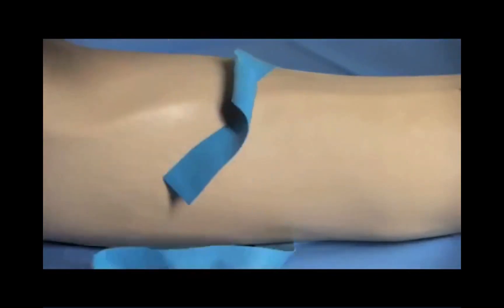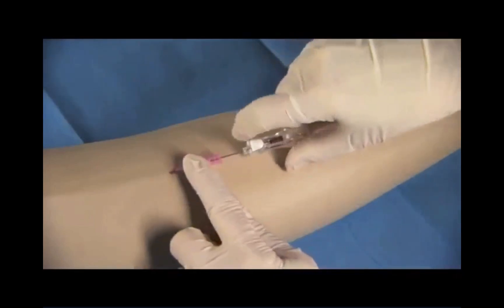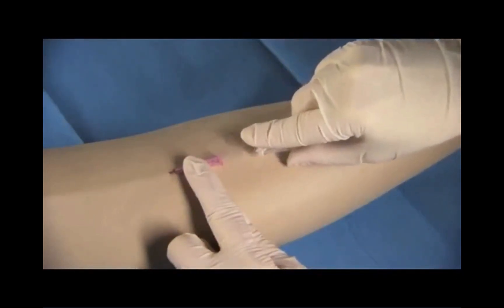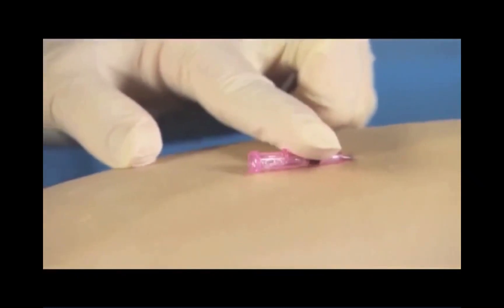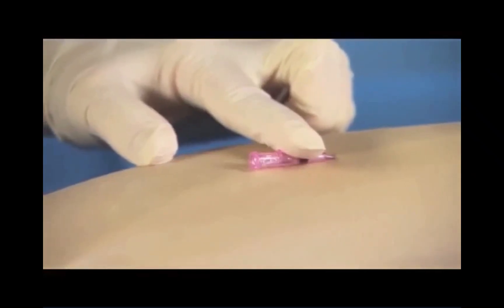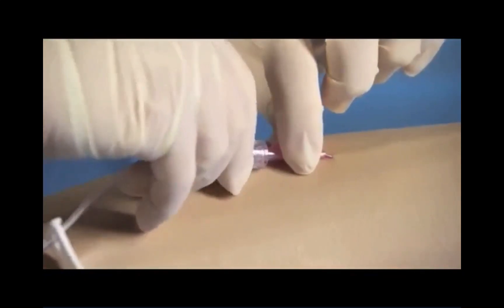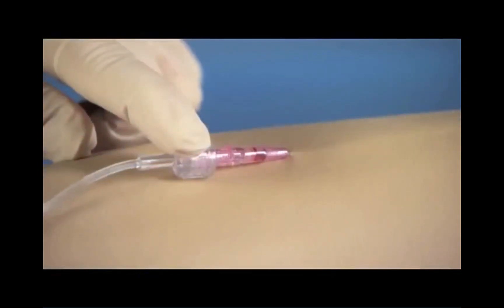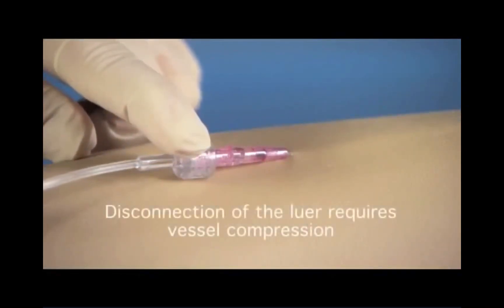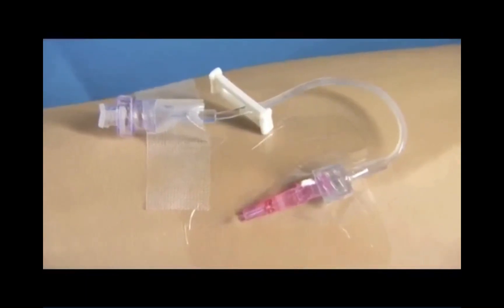Release the tourniquet. While stabilizing the catheter hub, push the white button to retract the needle. It is not necessary to occlude the vessel, as blood flow will be restricted until a secure luer connection is made. Connect any accessory devices and flush or begin the infusion. Stabilize the catheter and apply a sterile dressing according to your policy.